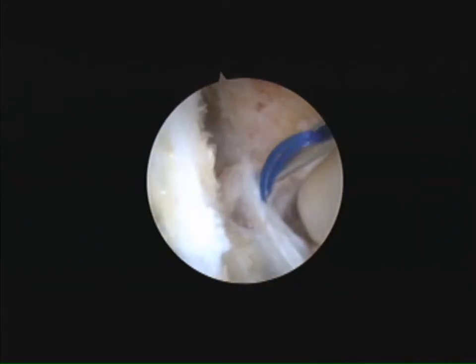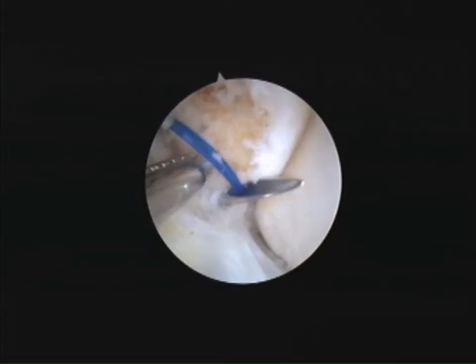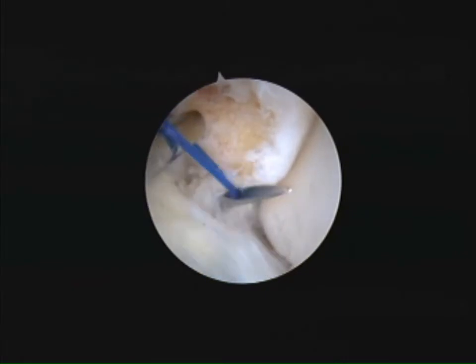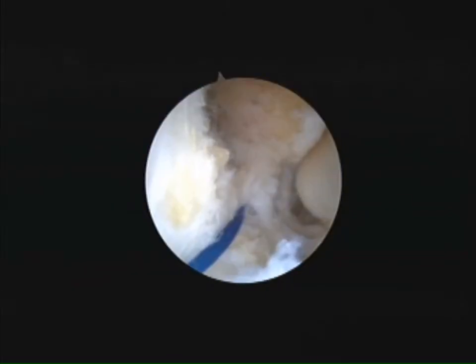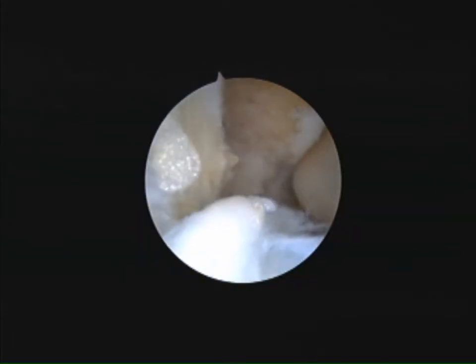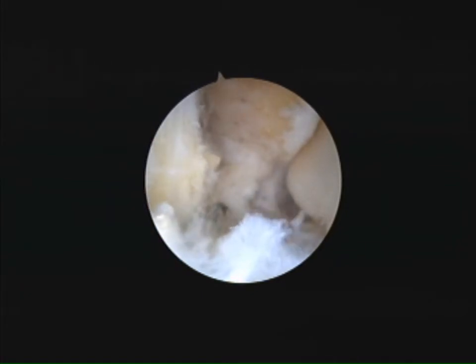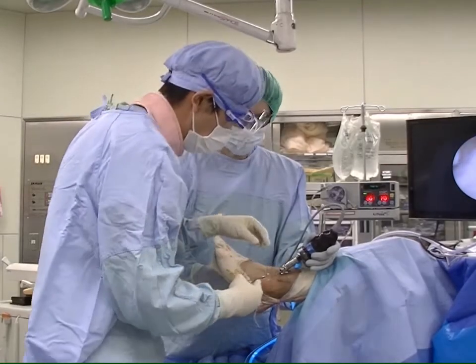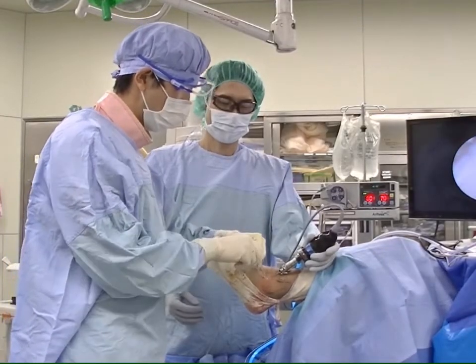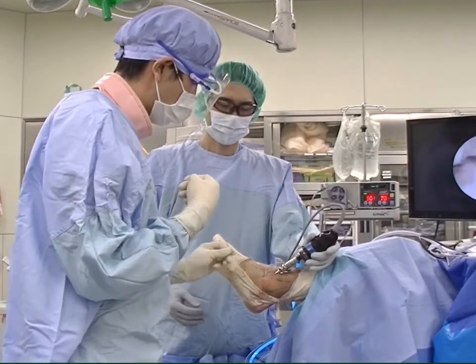An 18-gauge needle with a nylon loop is inserted into the center of the ATFL and CFL complex. The loop of the nylon is picked up through the accessory anterolateral portal, and a suture relay is performed from the nylon loop to a suture tape loop. The tape is picked up subcutaneously through the anterolateral portal. We use the locking hitch knot to capture the ligament strongly.